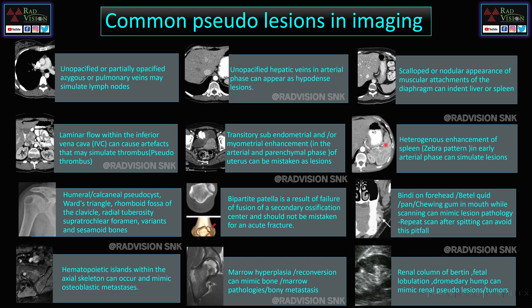Transient subendometrial enhancement in the early arterial parenchymal phase of the uterus can mimic lesions. In the early arterial phase there is heterogeneous enhancement of the spleen — excessive enhancement of the red pulp with hypointense white pulp — giving a differential enhancement or zebra pattern. This is normal and should not be mistaken for pathology; it should be confirmed in the delayed or venous phase.